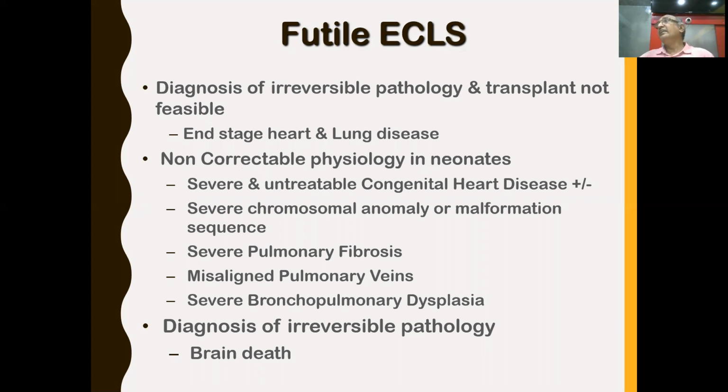Non-correctable physiology in neonates: if you feel the case has some congenital heart disease or some chromosomal anomalies which are non-correctable, again that becomes a futile ECMO, and then you have to think of coming off ECMO. Or in any patient, if the patient develops brain death, then again it's going to be a futile ECMO, and then you have to think of coming off the ECMO.